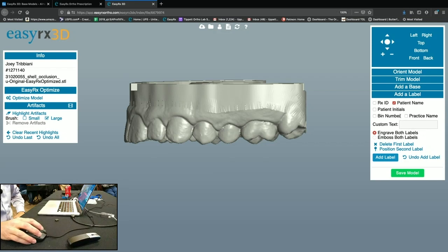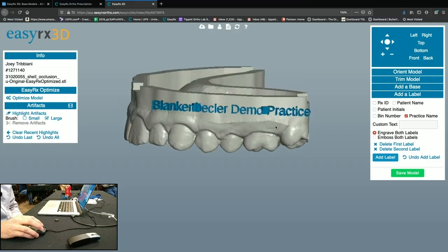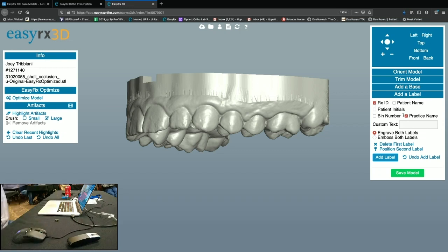Let's do practice name. Yeah, that'd be a nice long one. Position second label. So when you click on this, it takes all these parameters and puts it into your label. So that's the practice name. Maybe we don't want to put the practice name. So I'm going to delete that. Let's just put RXID. Now, if you have two of these together, it'll string them along.